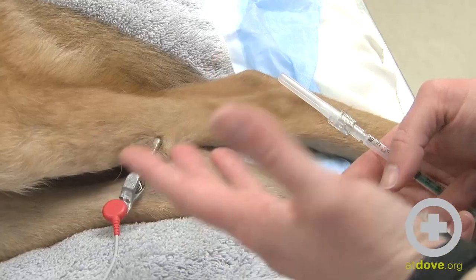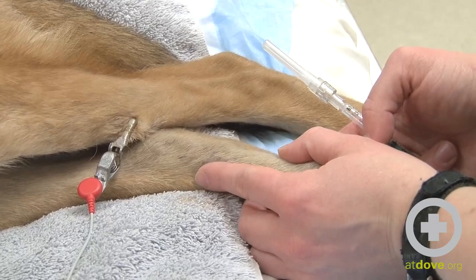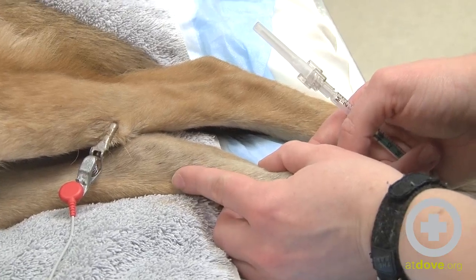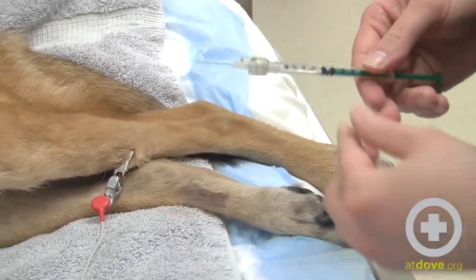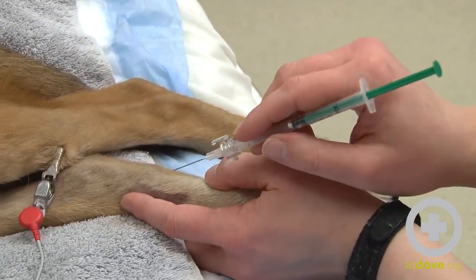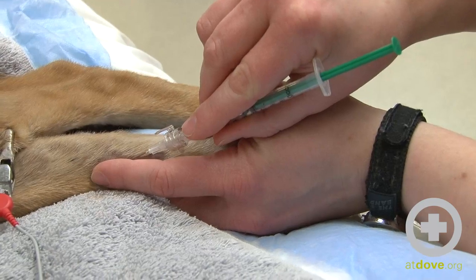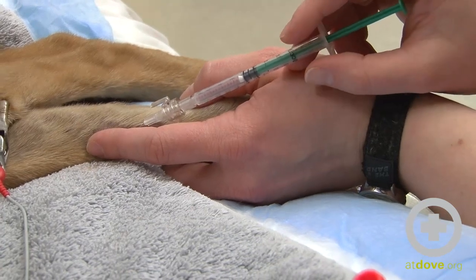What I like to do is use my left hand — the hand I don't use to poke — to try and locate the artery and feel it pulsing underneath my finger. This dog has had some blood pressure challenges so it's kind of faint, but I can feel it. The nice thing about these syringes is that I don't have to move my hand around with the plunger — I can just steady it. I'll feel for the pulse, and then using my left hand to help guide my right hand, I'm going to use a pretty conservative angle, go through the skin, and find the artery.